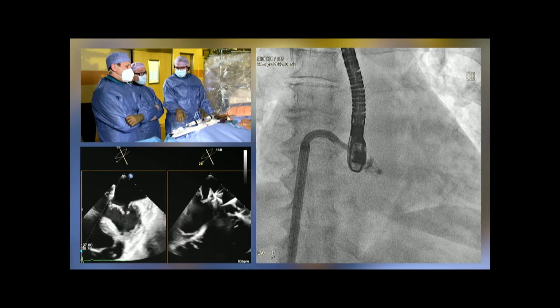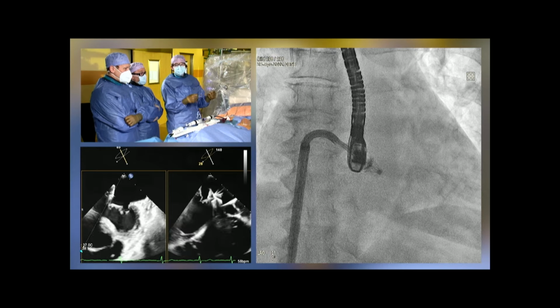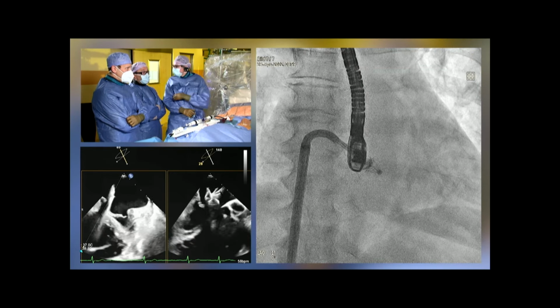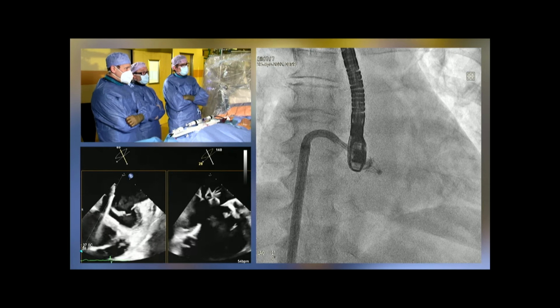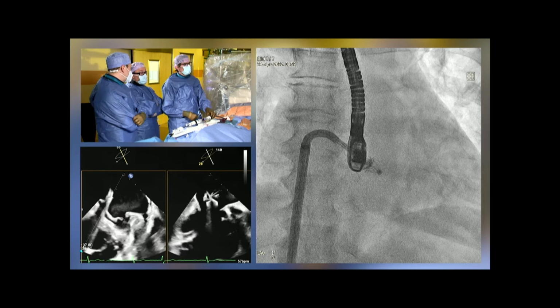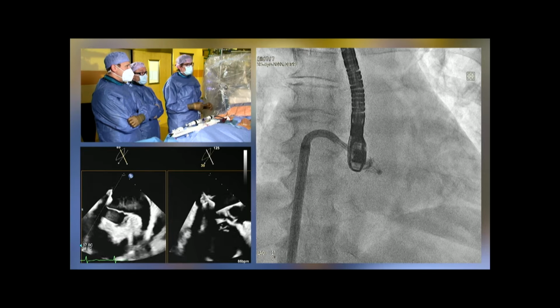But what we almost always do and use is the so-called single leaflet optimization maneuver, meaning that the first grasp is simultaneous, but then we optimize the one or the other leaflet independently. I must say, I changed my way of working a little bit. I'm very open for individual grasping, also for the first grasp and swing over. This technique really allows you to have an optimal visualization of the one arm and the one clasp with the leaflet, and then you can swing over to the other one and focus on that one.